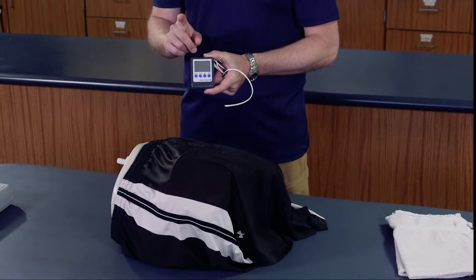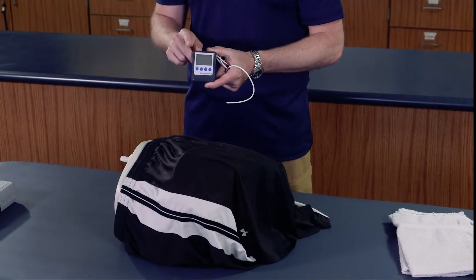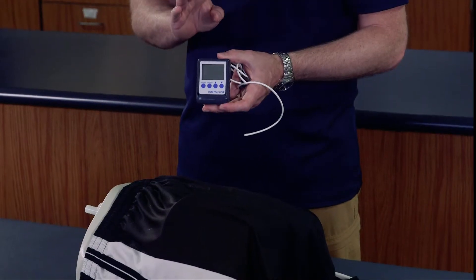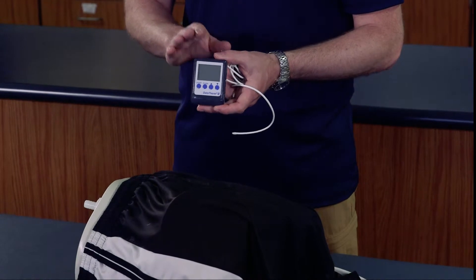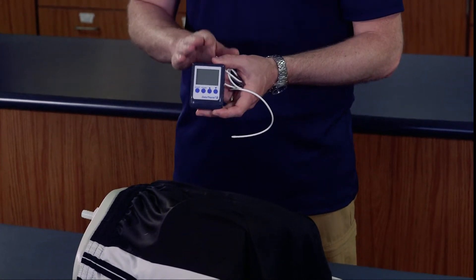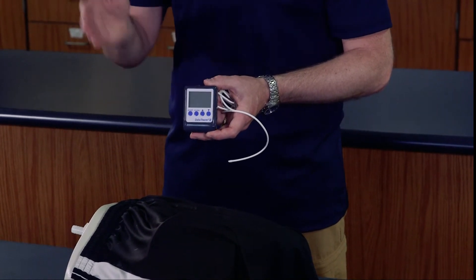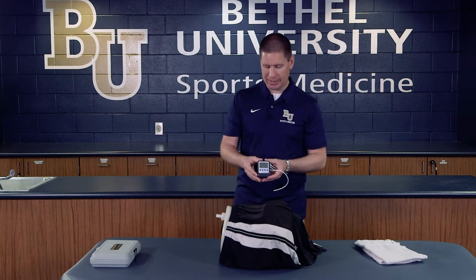One important thing to note is that the default on this device is that it always measures in Celsius, so you'll want to know how to change the mode button to Fahrenheit if you don't know that conversion. Our critical temperature threshold is anything over 102 degrees — if they are above 102, we're going to actively cool them with cold water immersion down to below 102, then remove them from active cooling. A reading of 103, 104, or 105 is an emergency situation where we need to actively cool them as quickly as possible.